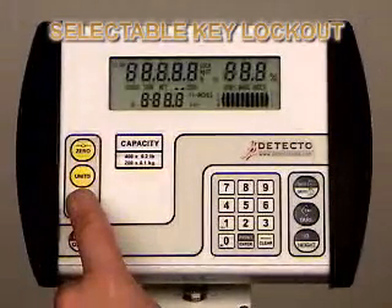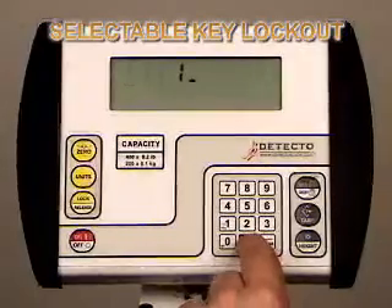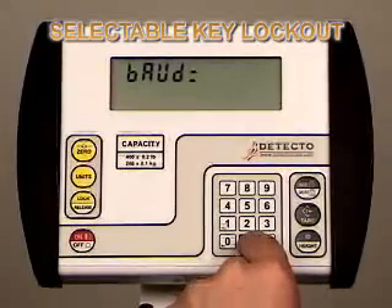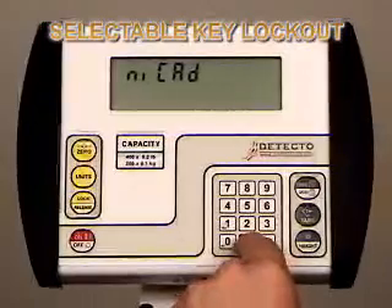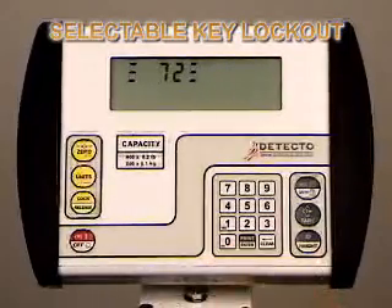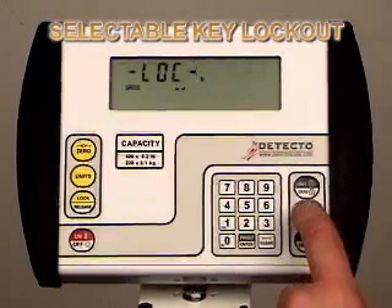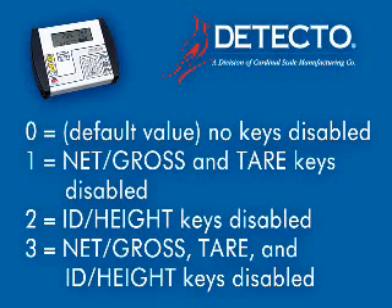With the 758C, you can disable keys you don't want to use. Power on the 758C and immediately press and hold the lock-release key until it displays setup on the indicator. Once in setup mode, press the enter key until you get to the BTN setting. Press enter once to show the current value. If the value displayed is acceptable, press the enter key to save it; otherwise, use the numeric keys to enter a new value, then press the enter key to save it. Allowable values are 0, 1, 2, or 3. In this case, we have entered 1 and are disabling the net/gross and tare keys. Toggle through the remaining calibration modes until you get to done and then hit enter. The indicator will go straight to weigh mode. As you see here, the net/gross and tare keys are locked out now. The numeric values for disabling keys are: 0 for no keys disabled (this is the default value), 1 for net/gross and tare keys disabled, 2 for ID height key disabled, 3 for net/gross, tare, and ID height keys disabled.